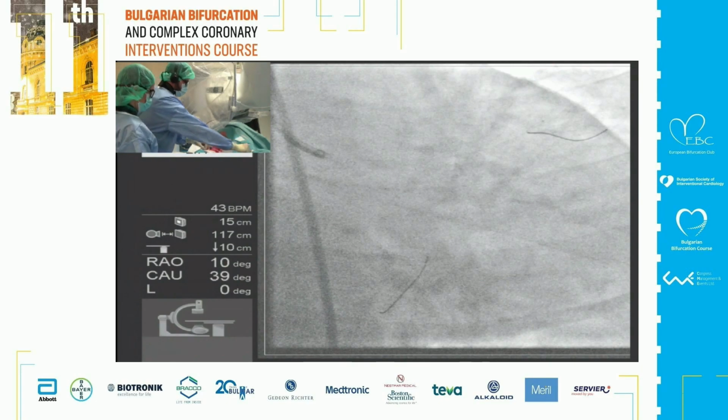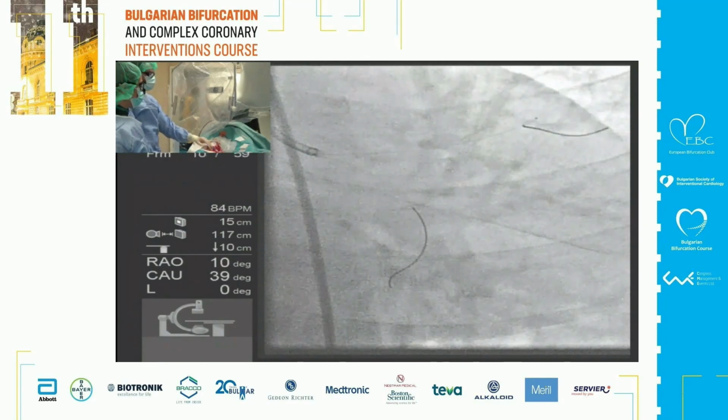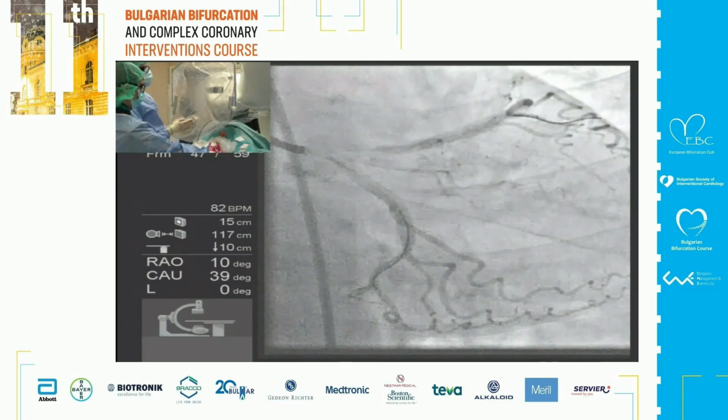I was really amazed to see people puncture occluded radials, echo guided, 3-4 centimeters or even a little higher. And it works fantastically, I have to tell you that. So essentially you have a direct visualization of the artery, and then you puncture the radial.